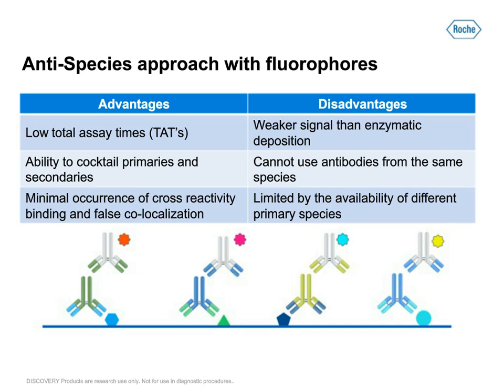But the one thing you might want to consider is, because it is enzymatic deposition, and fluorescence does tend to be a bit more sensitive, if you get such an intense signal, you maybe want to cut down on your primary antibody, maybe with a 1 to 2 dilution compared to what you were using in a brightfield assay, if you were getting bleed through into other filters or other fluorescent channels during your interpretation.